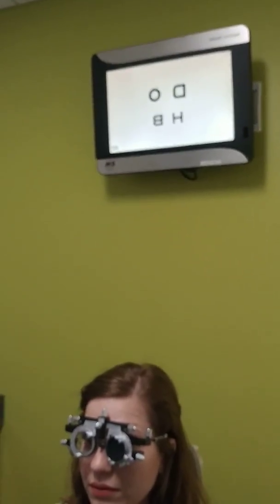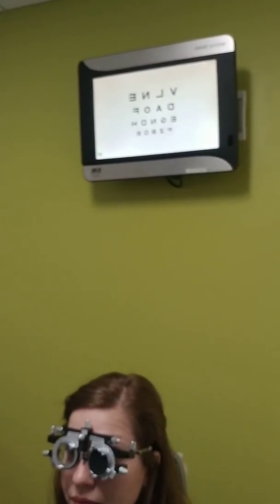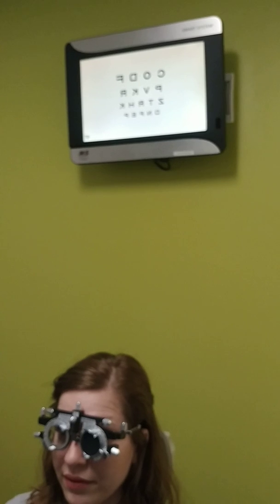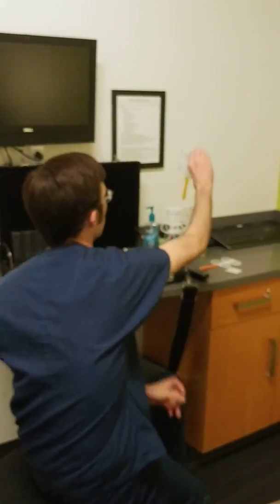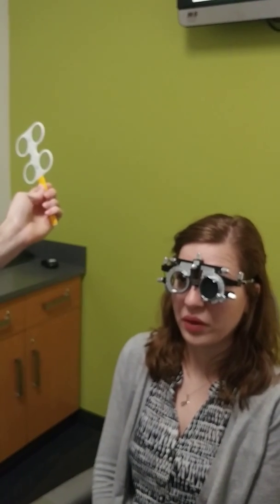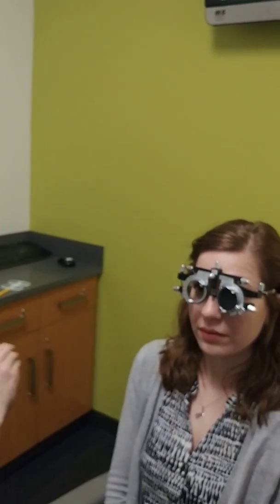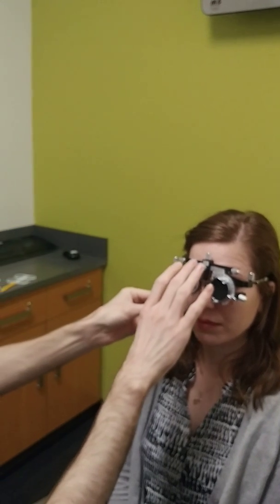I move down the chart and ask what's the lowest line she can read. She got to 20/60. That means we can go down to plus or minus 75 steps from here. More clear with the lens or without? Without. So instead of adding just a minus 75 in front, we actually want to change the back lens to a minus 2.75, so we don't end up stacking a bunch of lenses that make it even heavier for the patient.